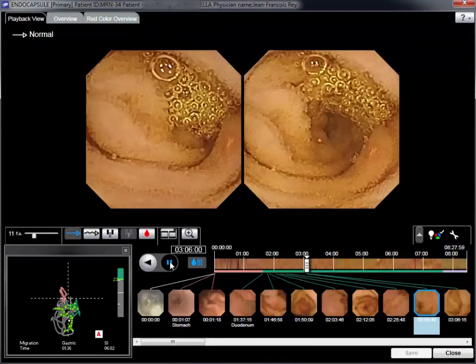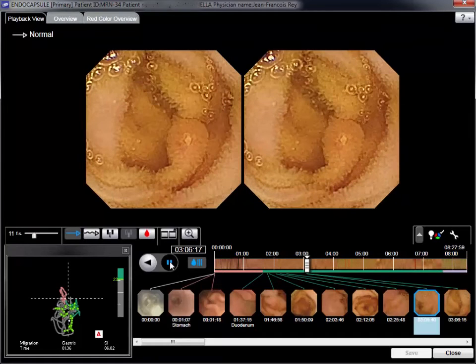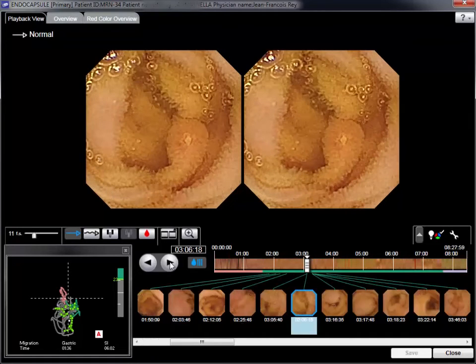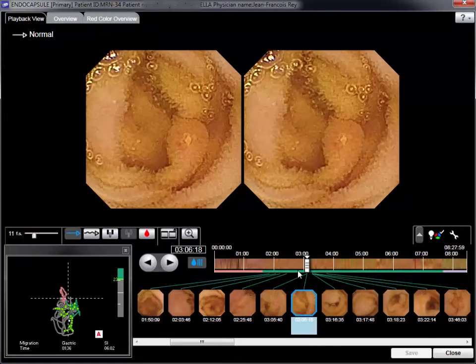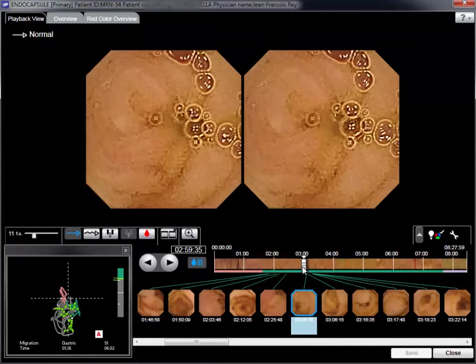Sequences have to be reviewed, as minute abnormalities are often missed. Express Selected Mode is particularly useful, as it significantly reduces the reading time.